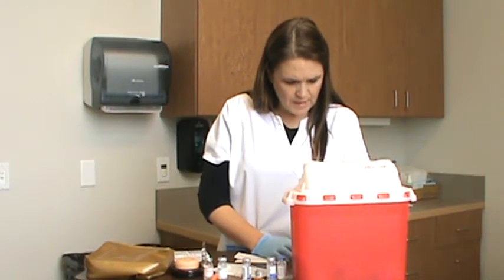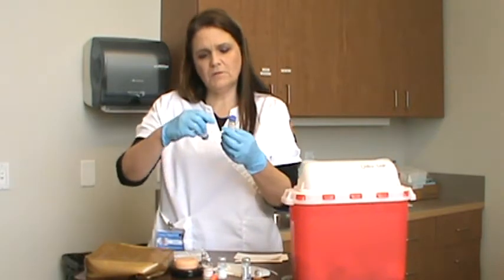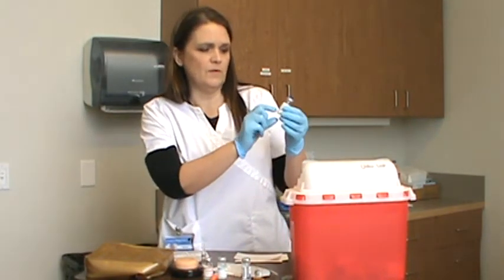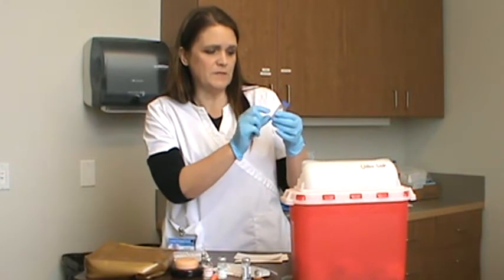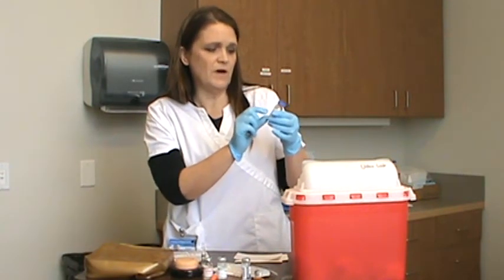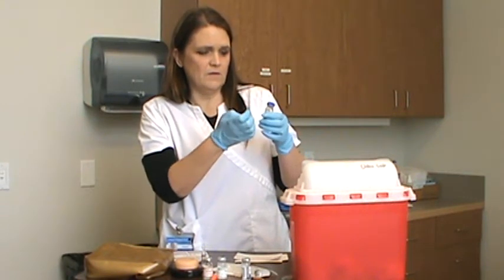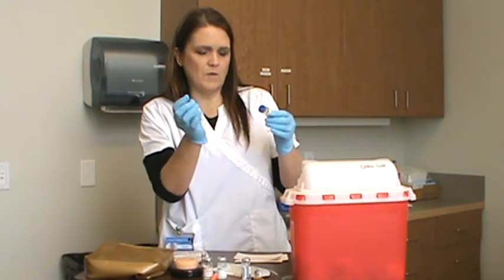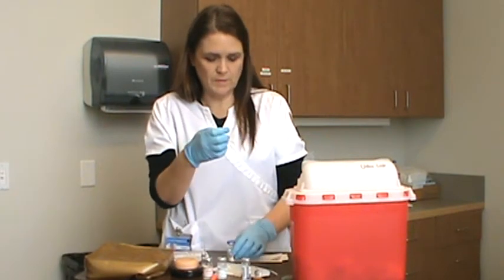I am giving 375 milligrams. This one has to be reconstituted. You can go anywhere from 300 milligrams to 500 milligrams. I'm using the 400 milligrams because she only needs 375. I'd reconstitute this with 7.5 mils of sterile water. This expires in 11 of 2020.